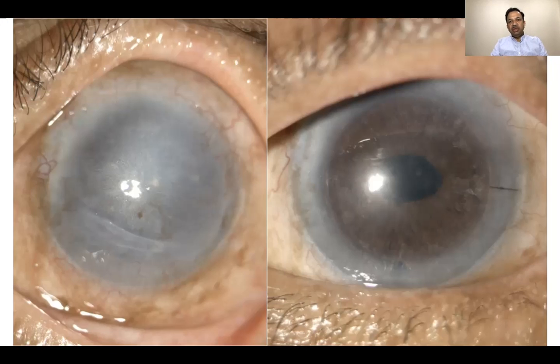So this is the same patient in the post-operative period. If you compare the pre-op and post-op, you can see that there is a significant change in the corneal clarity and the visual improvement of the patient.